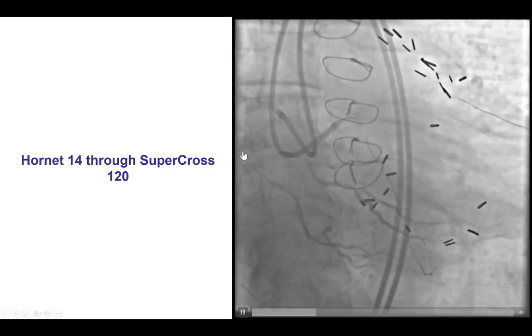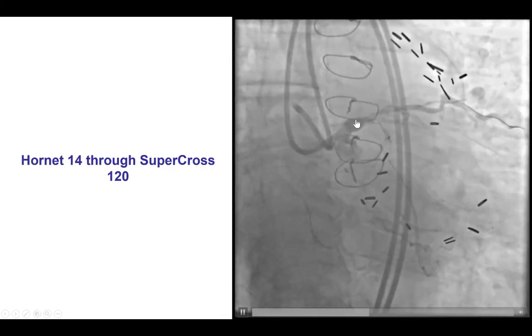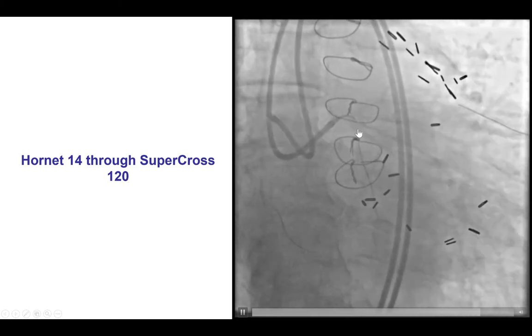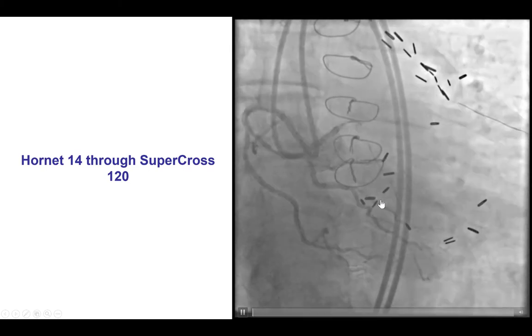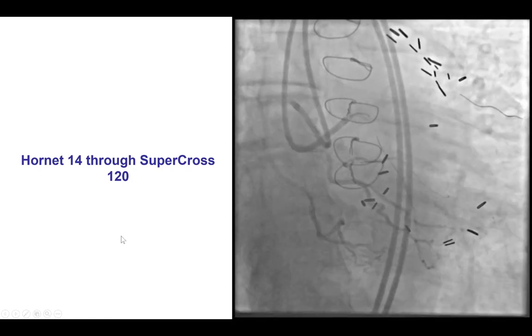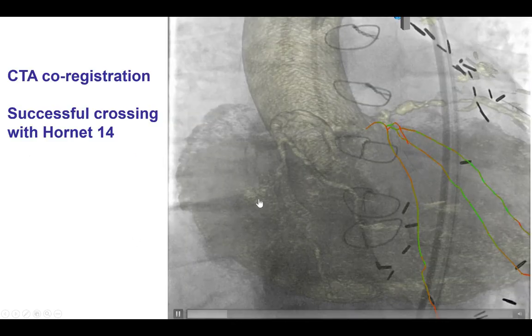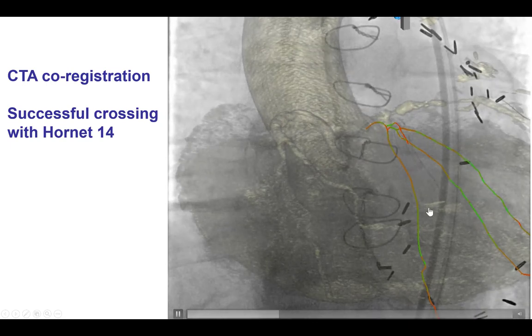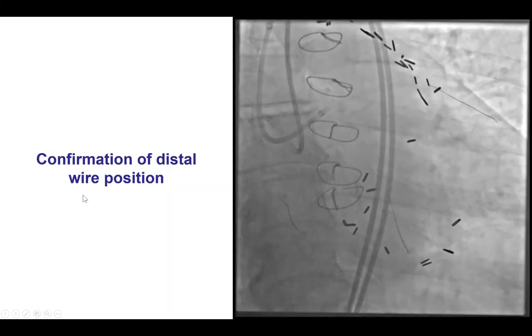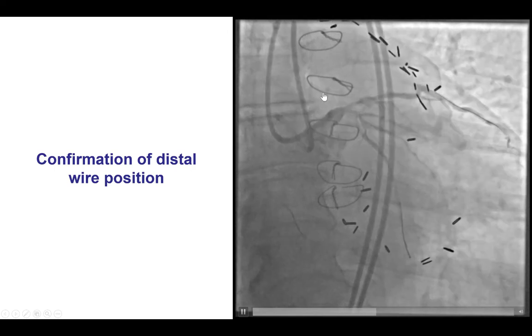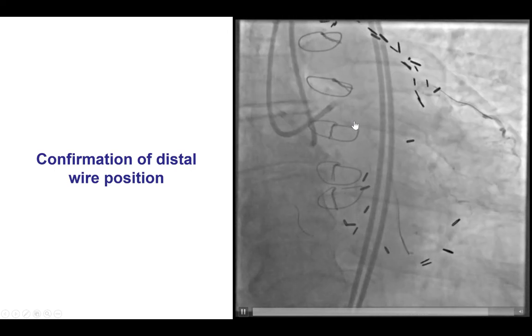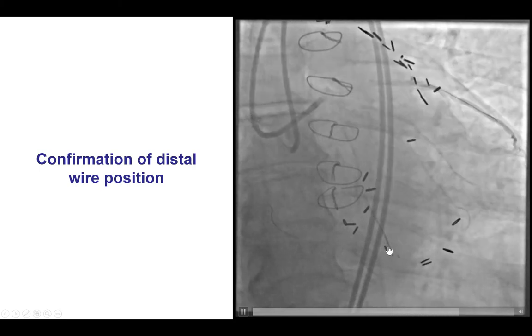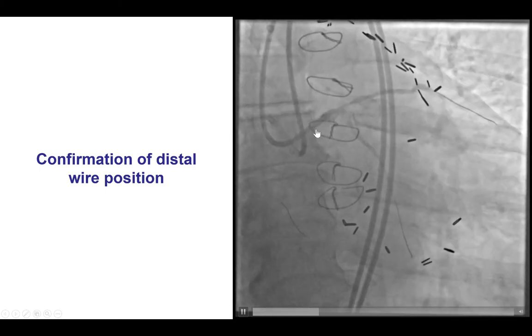After using the CT co-registration, we were able to advance a Hornet 14 guidewire through the Supercross, and that appeared to enter into the distal true lumen, which was confirmed by co-registration showing it following the course of the vessel. After a small balloon dilation, we did see that there was some flow restored into the distal circumflex.